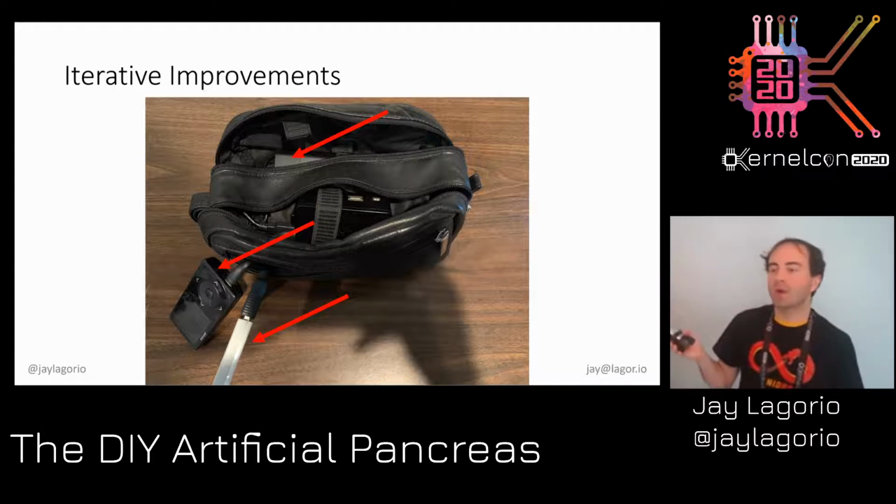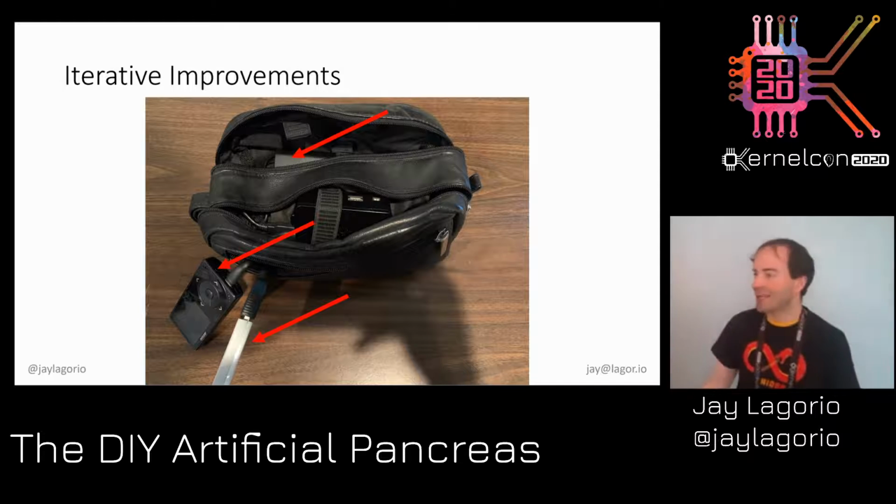And when I think about the large multinational medical conglomerate that is Medtronic, and in comparison, what is effectively randos on the internet that can make it work 10 feet away. Again, I don't know if it's malice or incompetence. I guess I leave that up to you. And finally, this is just the Raspberry Pi 2.